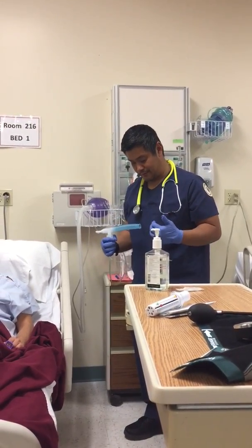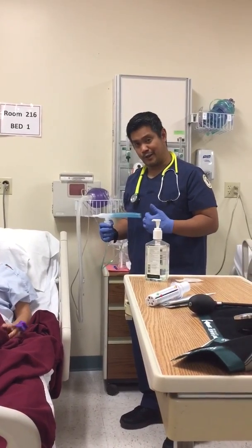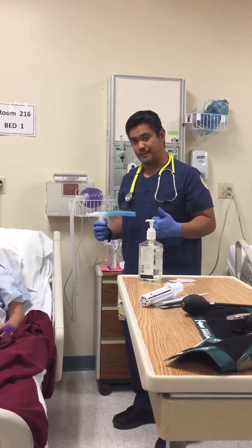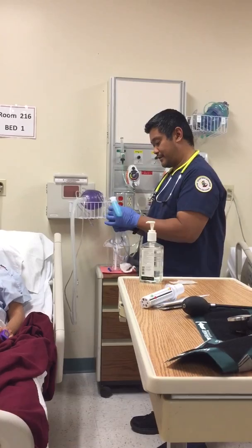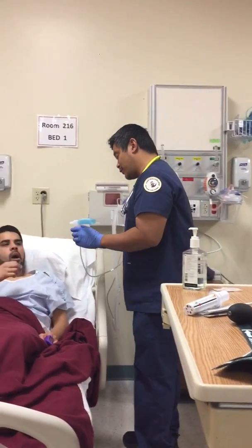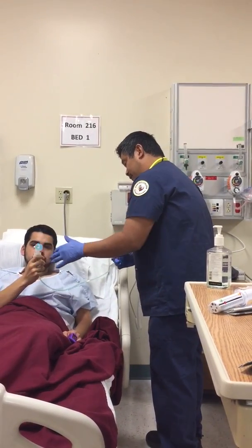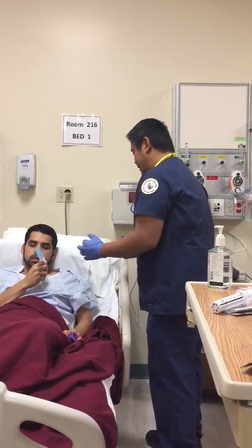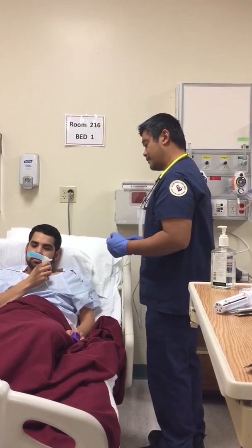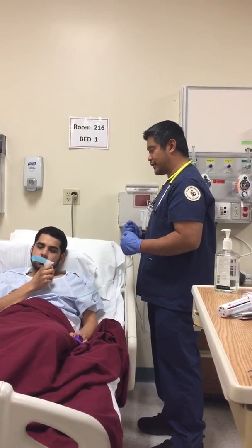You usually check before giving the SVN to the patient against a dark background, and you should have a white vapor. All right, Christian. So as I said, right over here, and you're basically just going to wrap your lips around over here. Let's hold it up about this angle. It's kind of gravity dependent, so just make sure the medication. Just go ahead and breathe in normally. And every 5th breath, go ahead and just take 1 big breath.